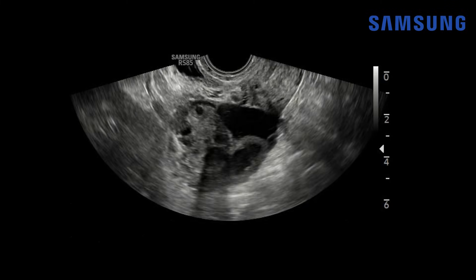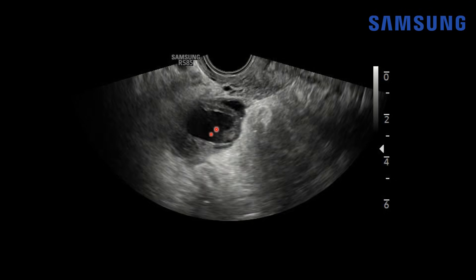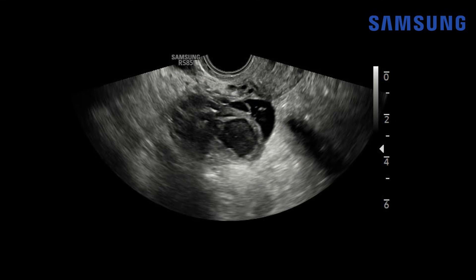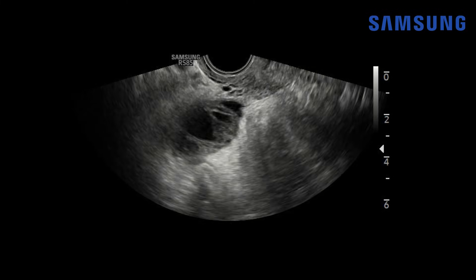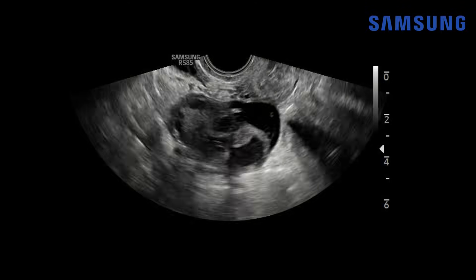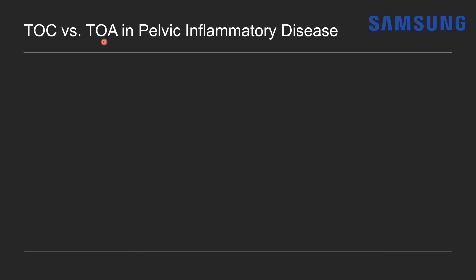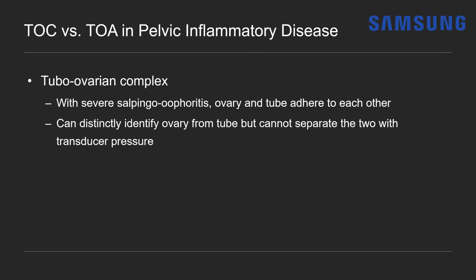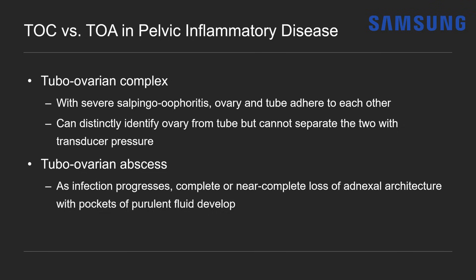On cine imaging, the transverse view shows that thick-walled tube with complex fluid adjacent to an enlarged ovary whose follicles are peripherally displaced. You can still distinctly identify it as the ovary; you just can't separate it from the inflamed tube with transducer pressure — that's a tubo-ovarian complex. If infection continues without treatment, it evolves into a tubo-ovarian abscess: you lose ovarian architecture, can't distinguish ovary from tube, and see multilocular pockets of purulent fluid with septations and irregular margins.